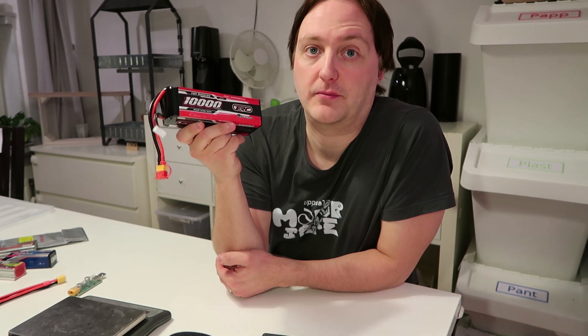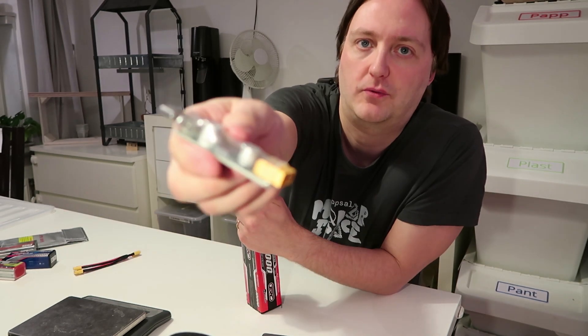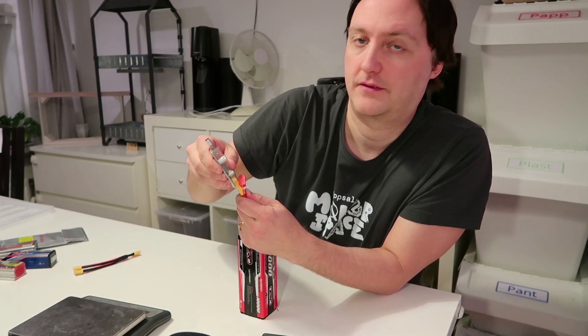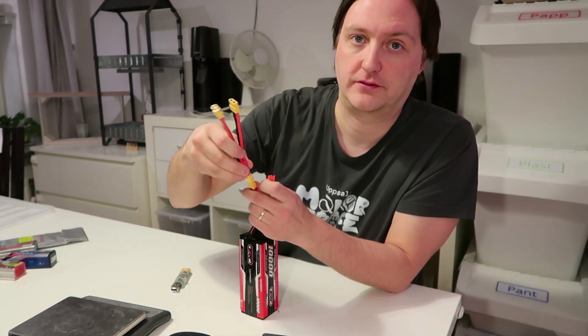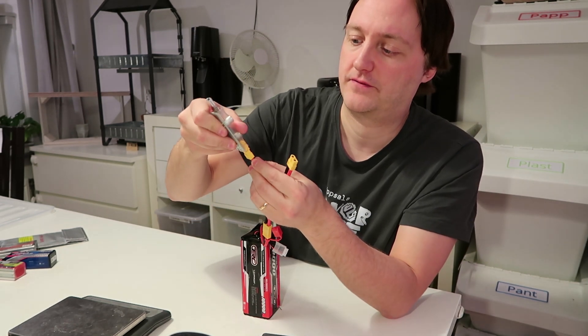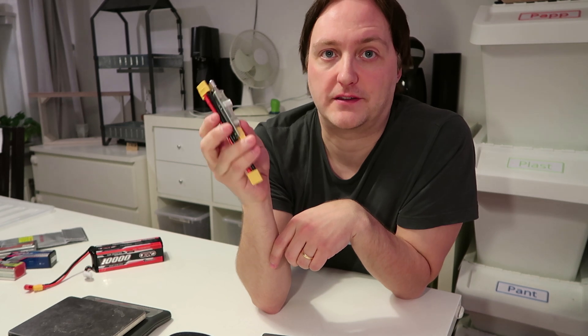One more thing: if you bring a large battery, you can also charge your phone or other devices from it so you don't need a separate power bank. You can plug in a USB charger directly to the battery. And if you also want to run the CPAP at the same time, you can use a Y connector — plug it into the battery, plug in the USB charger on one port, and plug in the CPAP on the other.